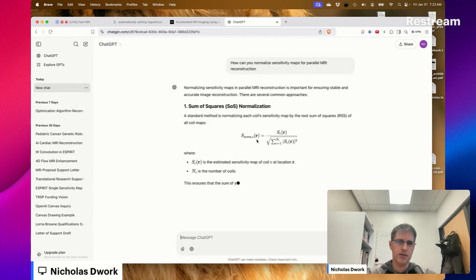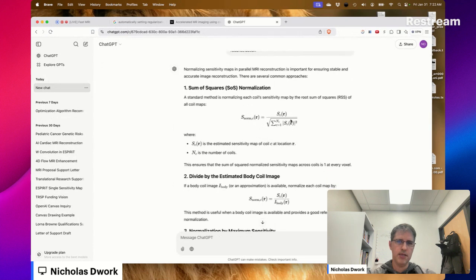Okay, this is reasonable. So you take the sensitivity map and you divide by the square root of the sum of the squares of the sensitivity maps.